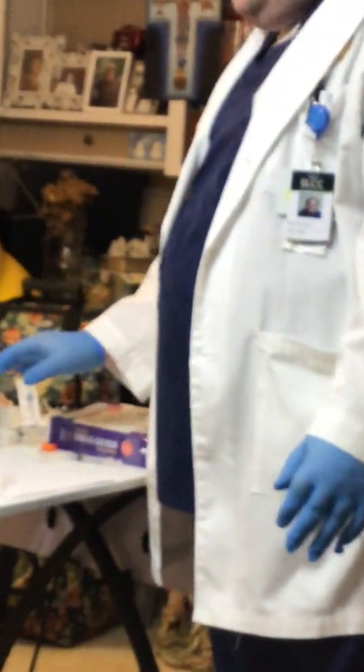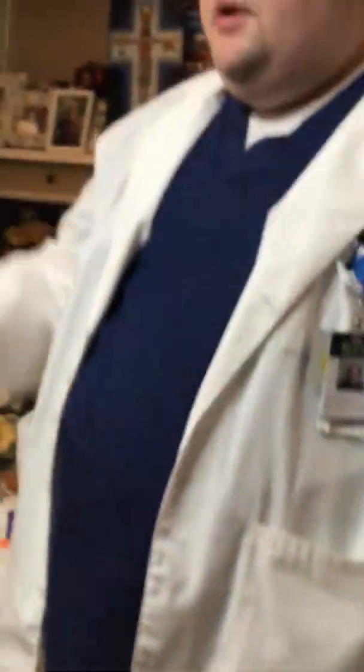I'm going to give the patient the proper instruction on this. There should be no blood coming out of it, or very little blood. And we're going to instruct the patient that we're going to come and look at it in 48 hours. And that's it. We're going to clean up our supplies, make sure the patient has everything he needs before we leave, and chart and document that we've done this, and follow up accordingly.